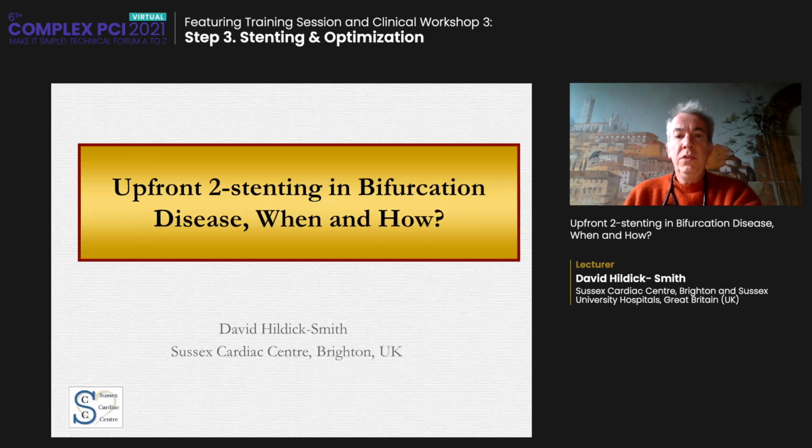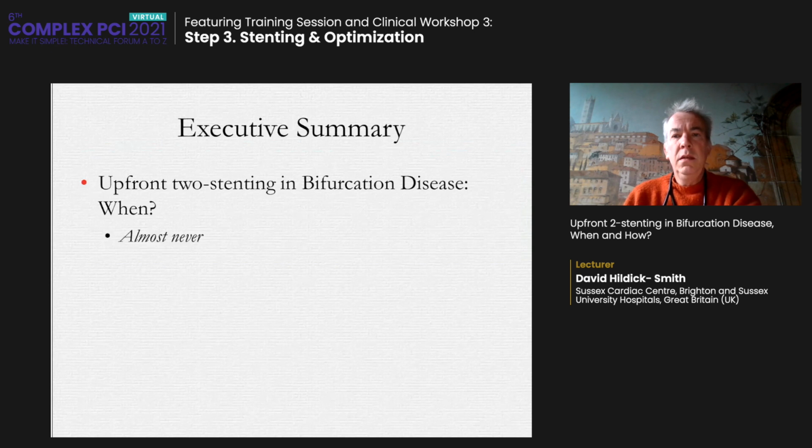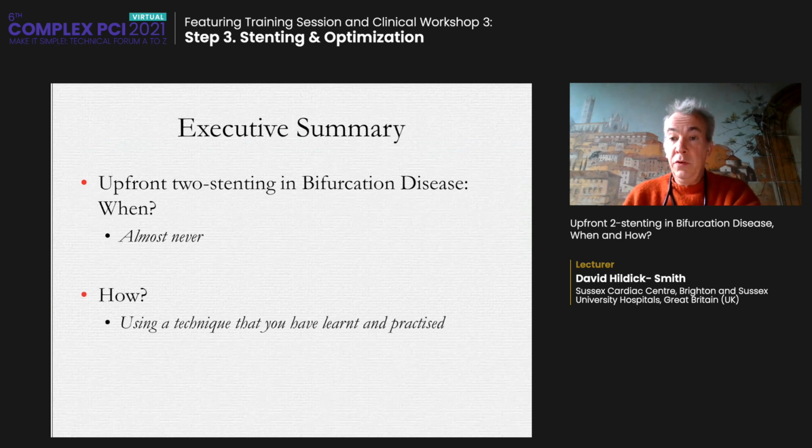So, when to do two stents up front? I would say that the executive summary of my talk, in other words, the brief report, would be that when to do this? Honestly, almost never. And how to do it? Well, if you're going to do it, then use the technique that you've learned and practiced, whichever that technique is.